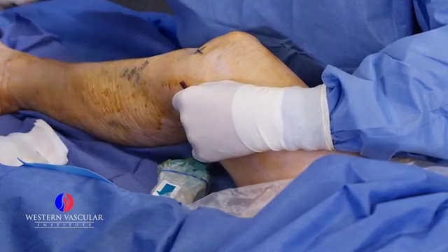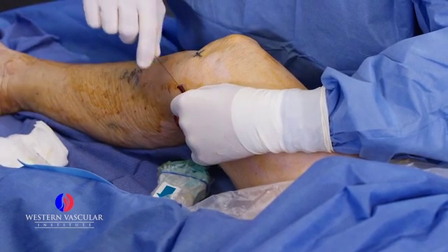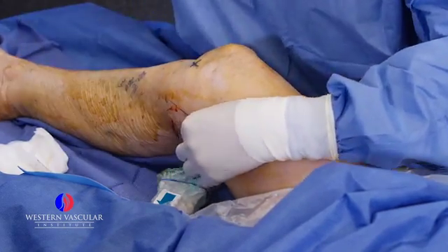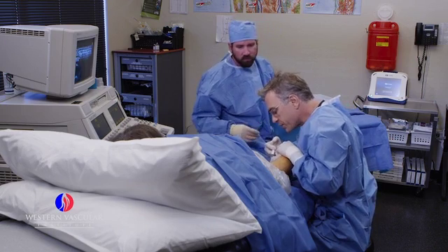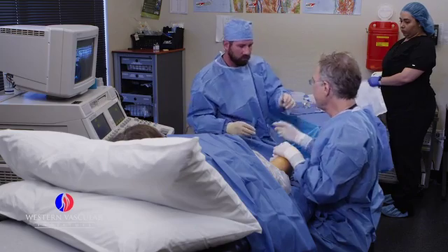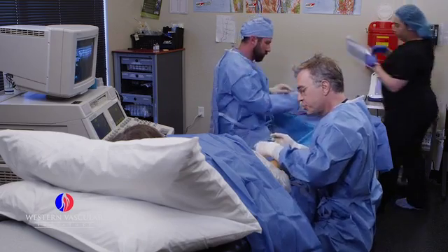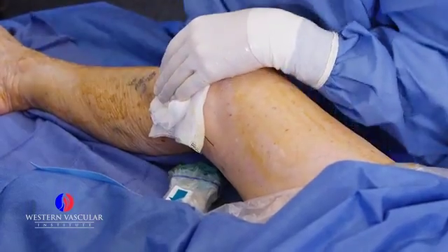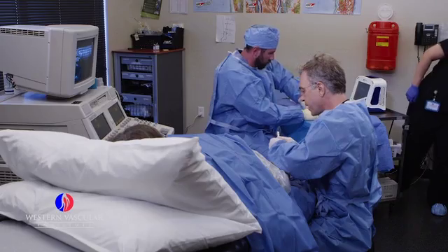Then we're going to thread a little tiny wire. We're going to give her a little bit more local here so she doesn't feel any more discomfort at the entry site. We make just a tiny little nick in the skin because we're going to put in an access sheath — a little tube that we gain access into the vein with. We work through this tube, which has a little valve on the end, and the ablation catheter goes through that.